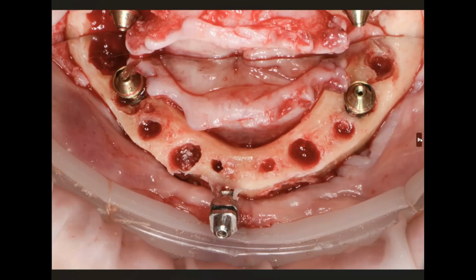Now here you see us going through our full arch surgery. We've got all the teeth out, and I've got the posterior implants in place. Now, if you had been doing this the old way, if you had fiducials in the posterior, you would have had difficulty with your incision lines, and you would have difficulty with your reflection of mucosa, and then you would have had difficulty completing your alveoloplasty to completion.